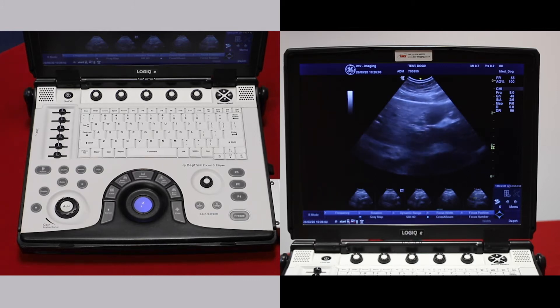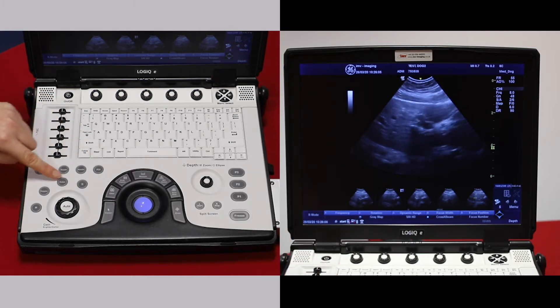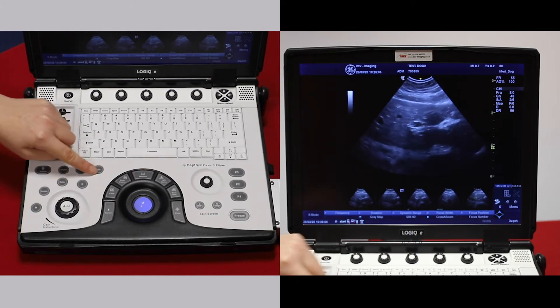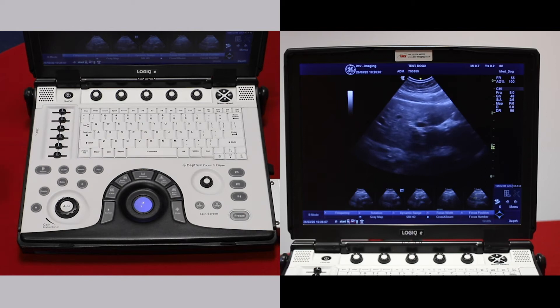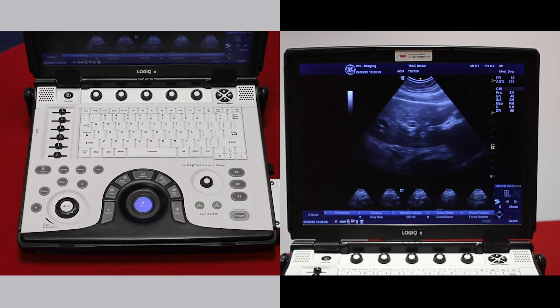We have a range of functions other than B mode. Most of them are on the left hand side of your gain button.